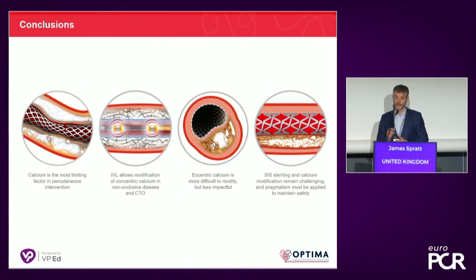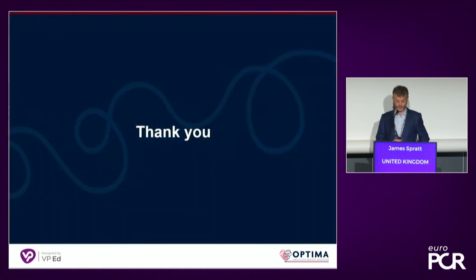And just one point to leave you on is that we did obviously look at this within the CONSISTENT study, and we found that if you've got good MSAs, these stents are as durable as they are within intraplaque outcomes. So thanks for your attention.